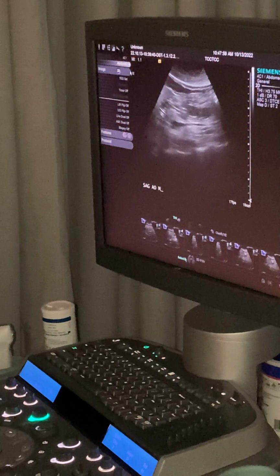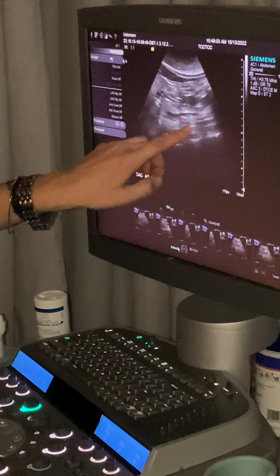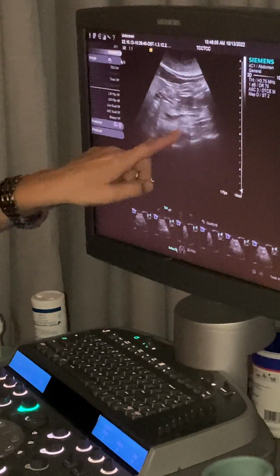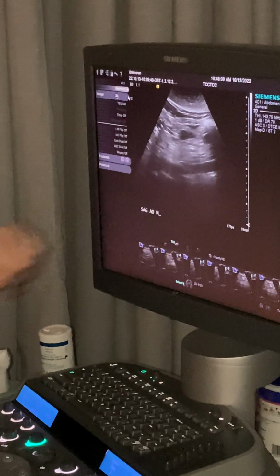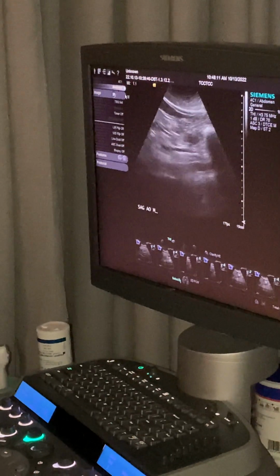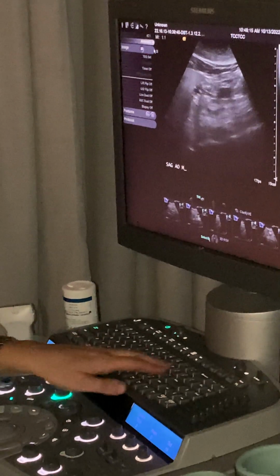Okay, so that's the porta splenic confluence, and then it's going to be coming between here. And then that left renal is going to go right between the two. So we're looking somewhere in the middle of this. Okay, and we did get a little bit of color flow in the IVC for whatever reason. Okay, so who's up next?